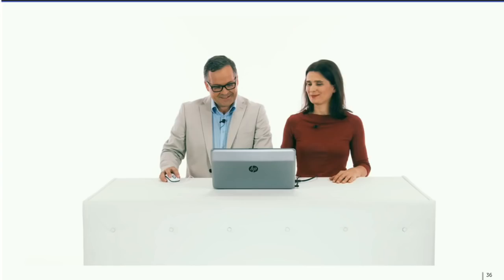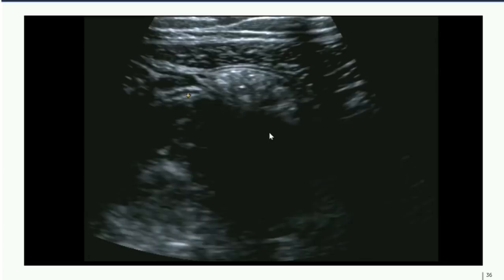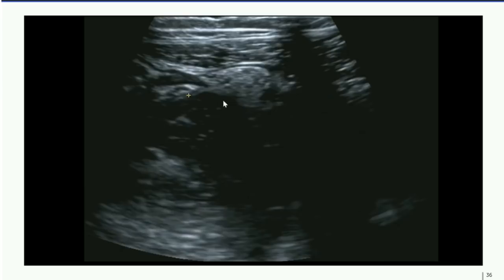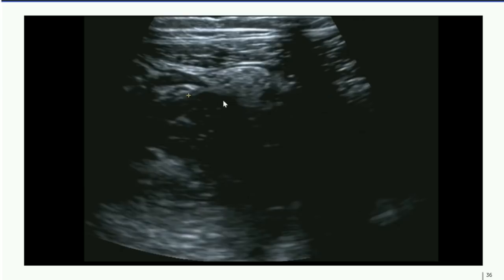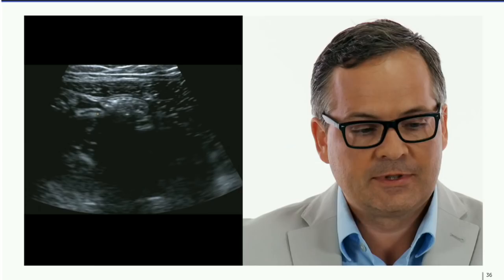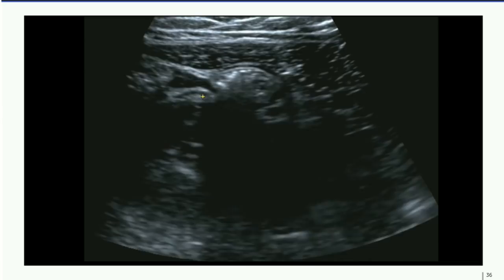We can see an intestinal structure with peristalsis — the terminal ileum — and situated dorsally, a small tubular structure without any peristaltic movement: that is the appendix. In this case we use the linear probe for higher frequency, giving a more detailed picture of the appendix, since higher frequency means higher resolution.